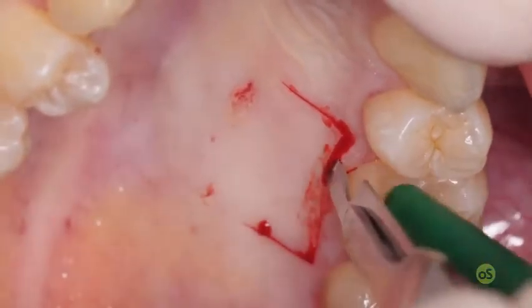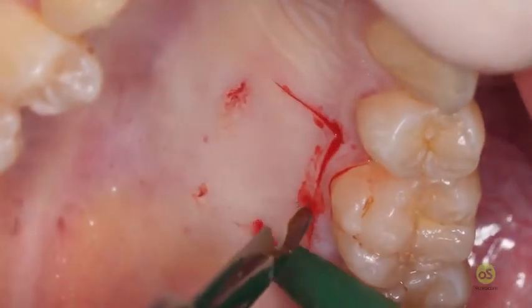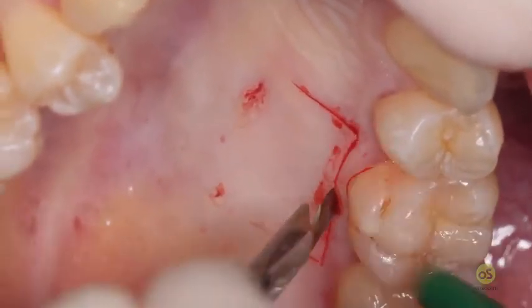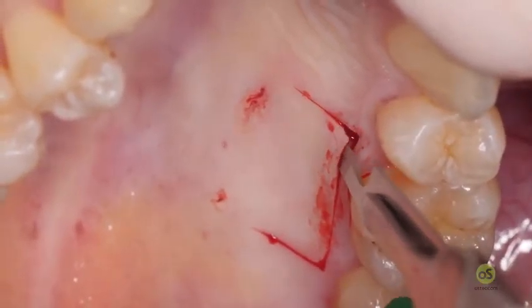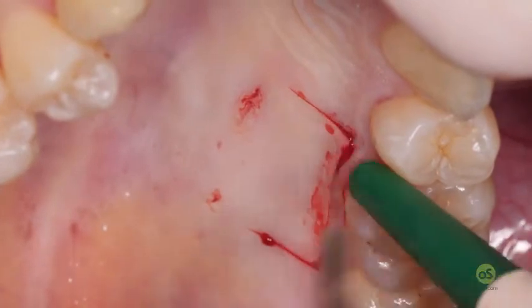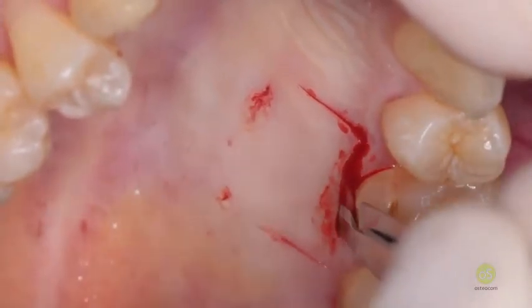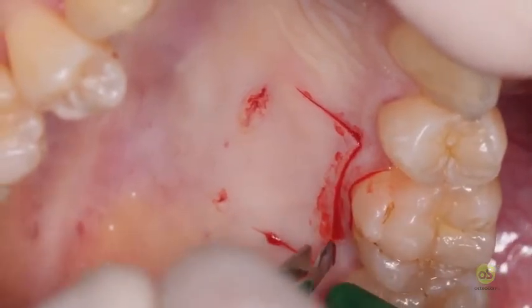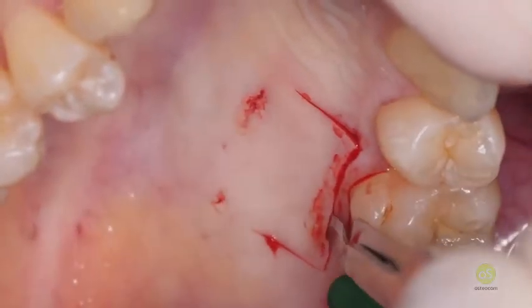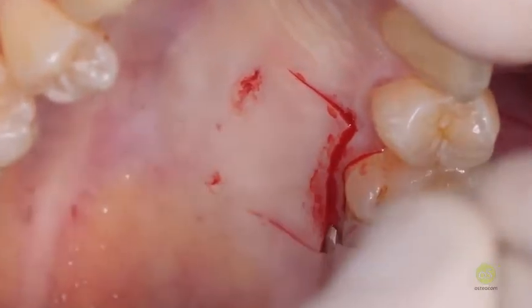Bevel, rotation, same thickness. Bevel, rotation, same thickness. Rotation means parallel to the soft tissue. Bevel, rotation, same thickness. Bevel, rotation, same thickness.